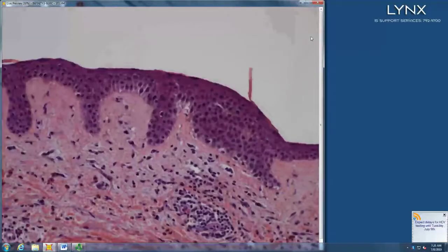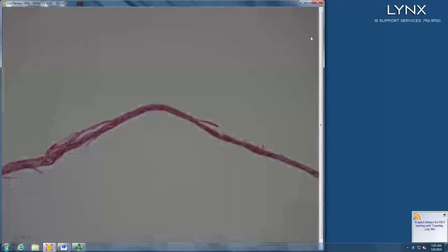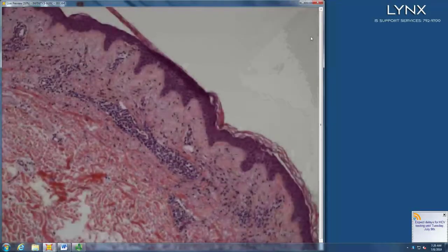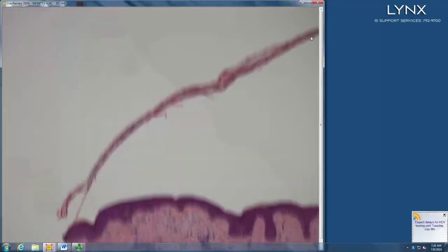There's not a whole lot of corneum to look at in this case. It's up above. There's not a layered corneum, basket weave on top of compact, which is a helpful clue to dermatophyte. And then id reactions can look like anything. So, okay, very good. Dermal hypersensitivity, and this one was actually later stage urticaria.